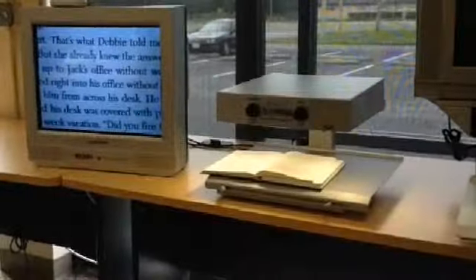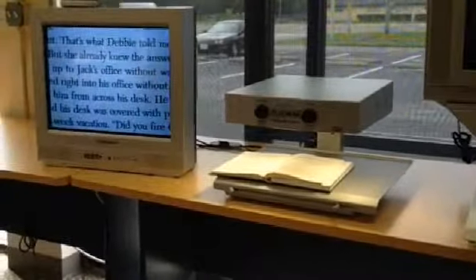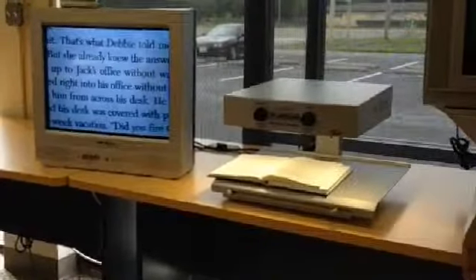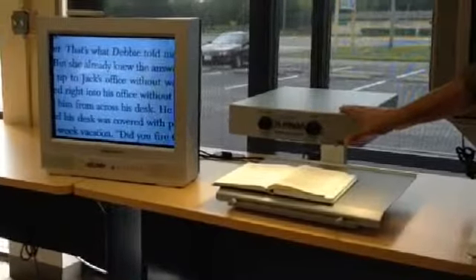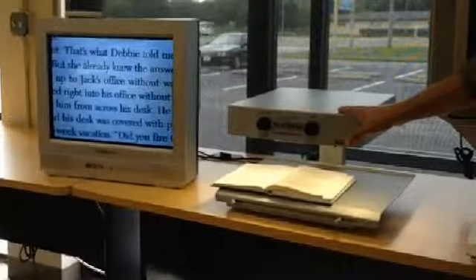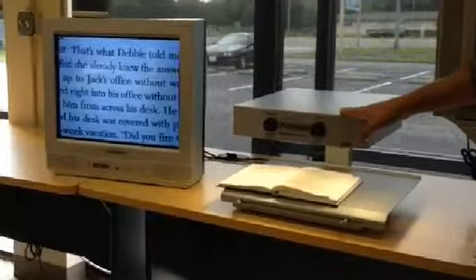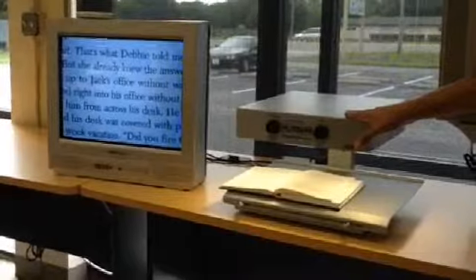Hi there. Today we're going to demonstrate the Patriot Platinum 20-inch CCTV desktop video magnifier. On a 20-inch display, the device magnifies from anywhere from 3 times up to 160 times. The nice thing about this device is that you can attach it to any monitor of your choosing, which will allow for an increase of magnification depending on the size of the monitor.